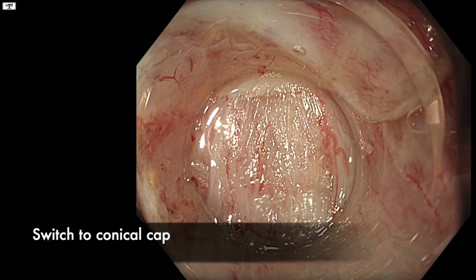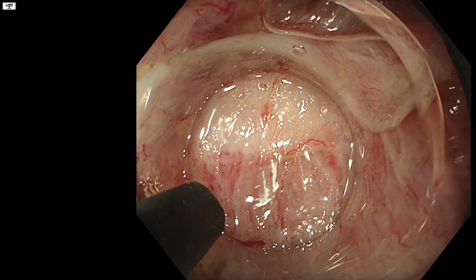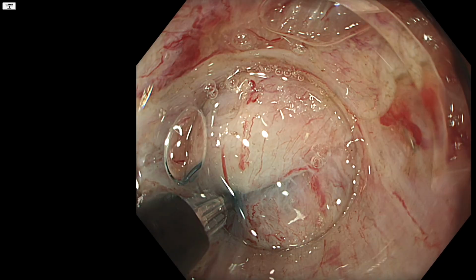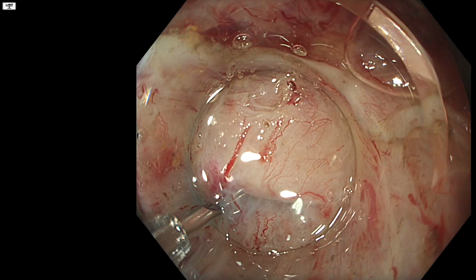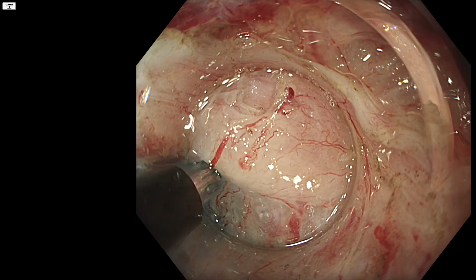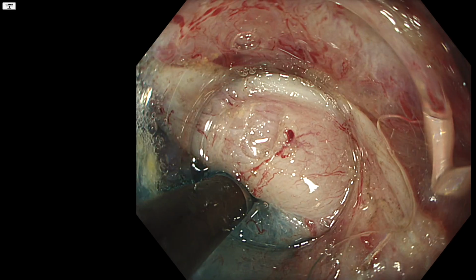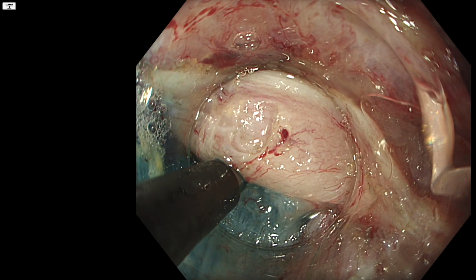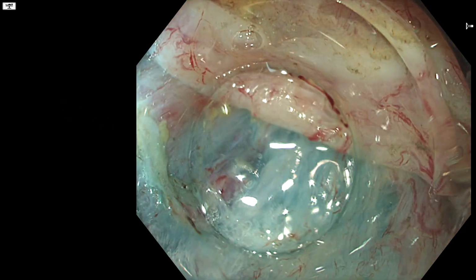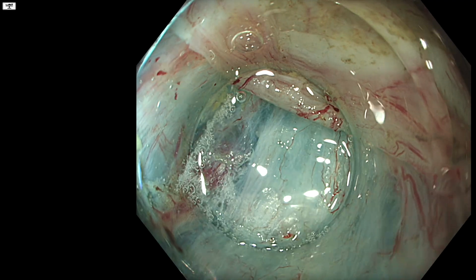So now we've switched to a conical cap. This is the Fuji DH30GR, which is a 7mm tapered tip, and which in a narrow intermuscular space actually works quite well, often better than the straight cap. The conical geometry engages tissue quite effectively and allows smoother advancement, especially when maneuverability is constrained. We then inject a little bit more solution to open up the space and continue with the intermuscular dissection.